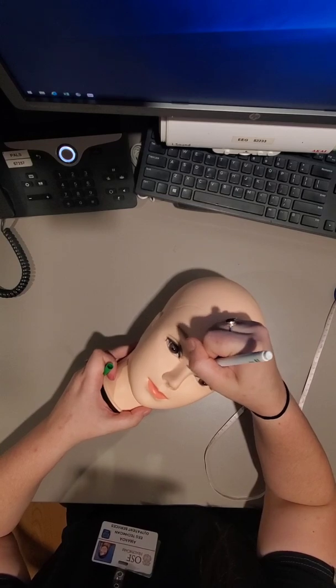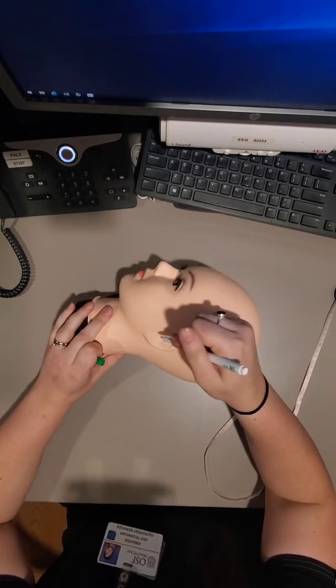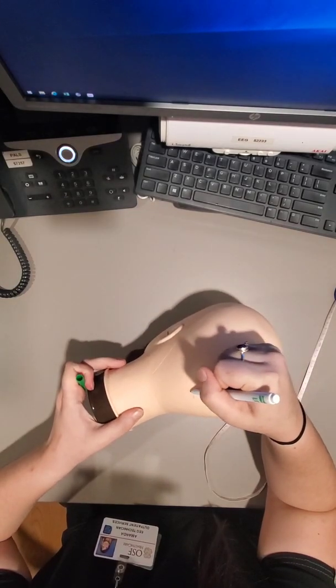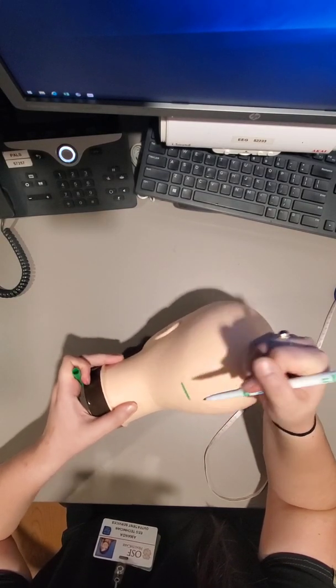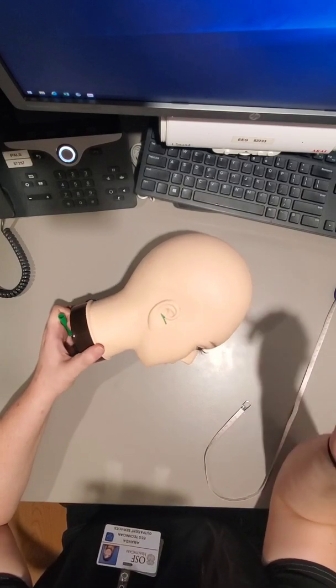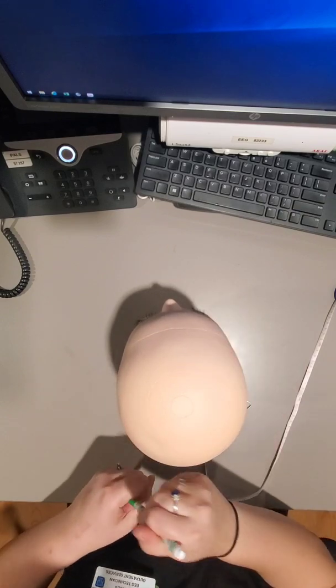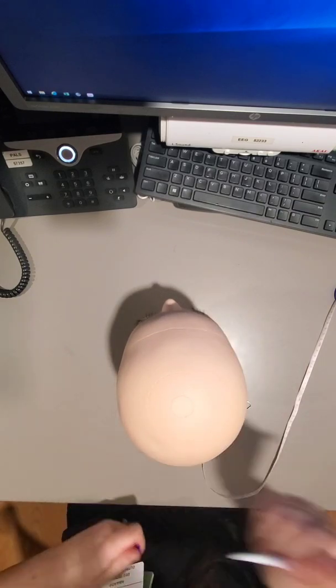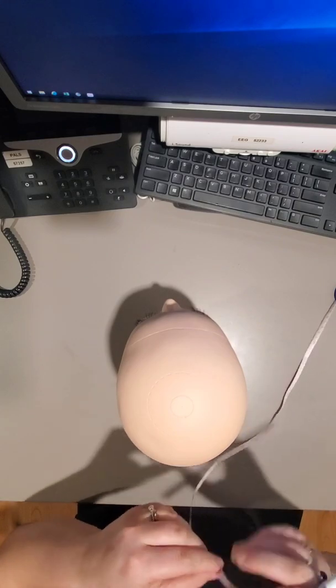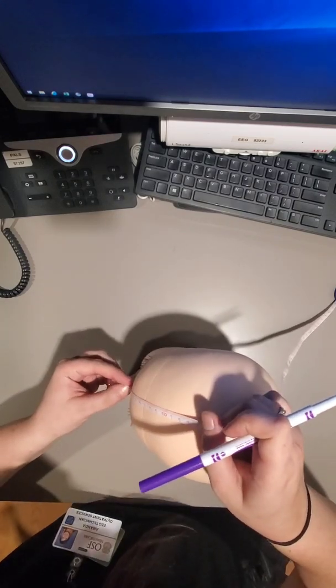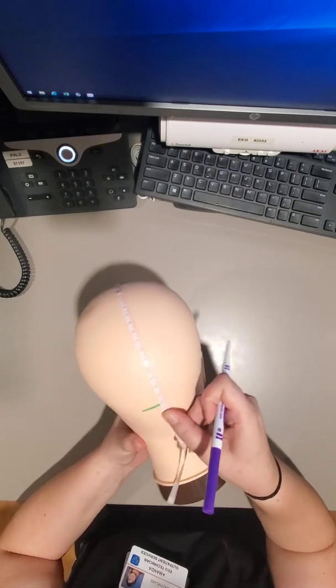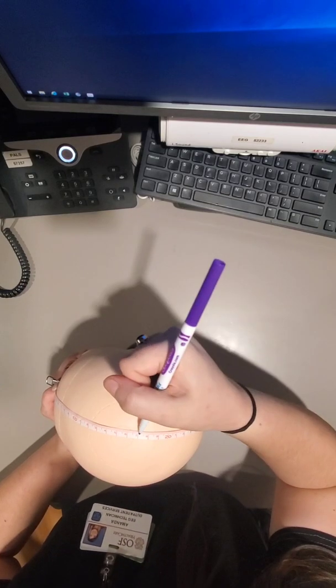I'm going to measure from the nasion to the left pre-auricular point, and then right pre-auricular point. Now I'm going to measure from the nasion to the inion. 34, half of 34, it's 17.